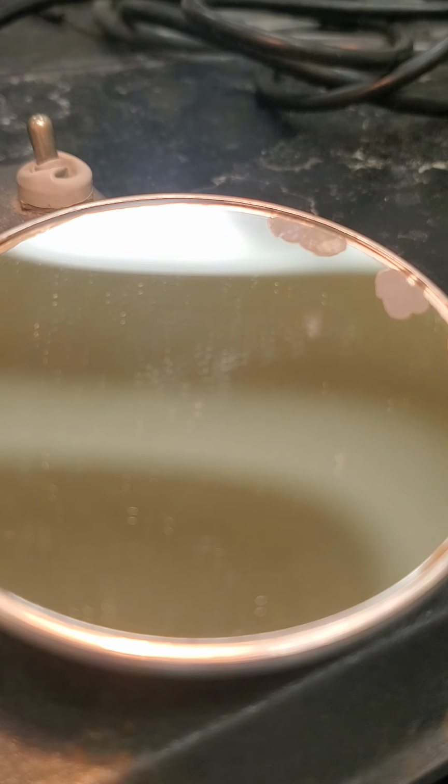Okay. So now that we've read 1 through 9, where am I at? Okay. We are going to discard everything but tube number 6. So if you remember, tube number 6 we're going to treat like a weak D. So I'm going to save that. We're going to incubate that later with some of our other tubes.